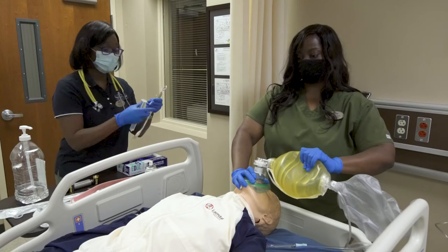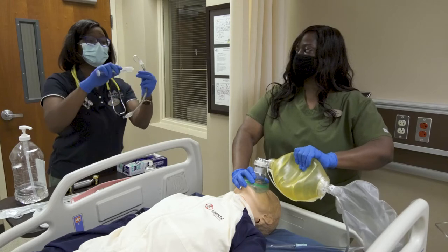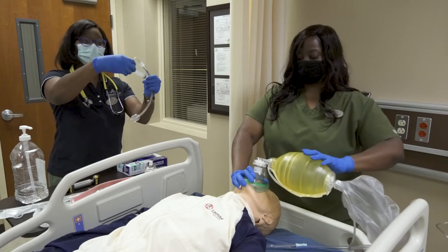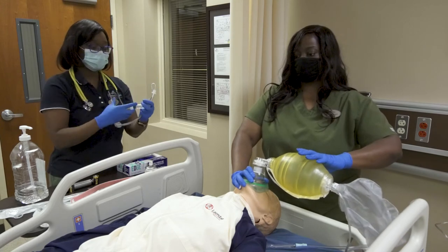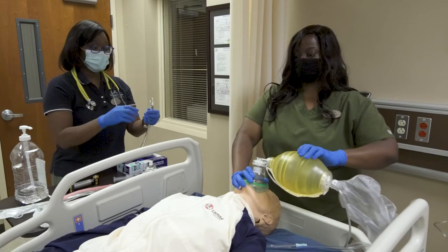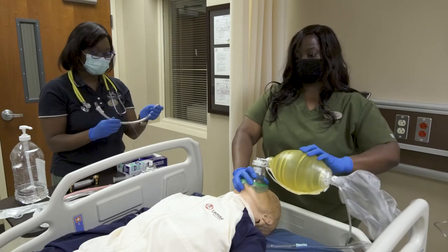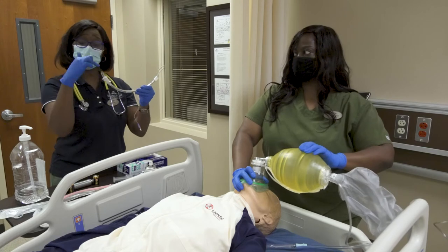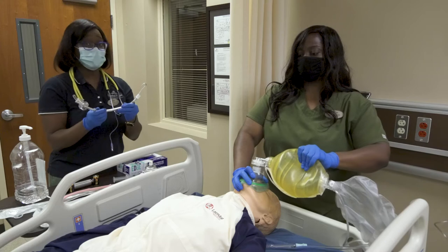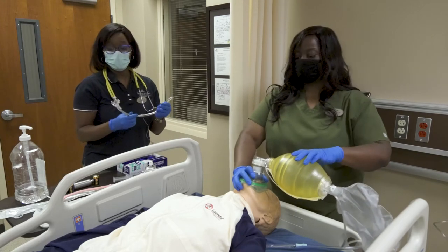As your assistant prepares the endotracheal tube, the assistant would check the integrity of the cuff by inflating air into the cuff, making sure that the cuff has no leaks. If no leaks are found, deflate the cuff. Make sure that the stylet does not protrude out of the end of the endotracheal tube. Also make sure to keep the Murphy's eye as unobstructed as possible.